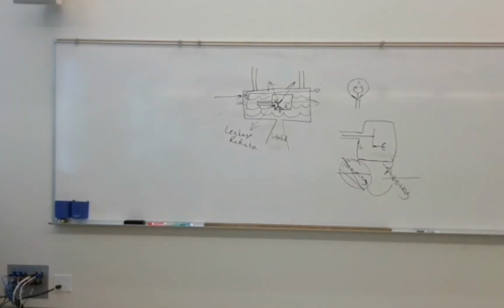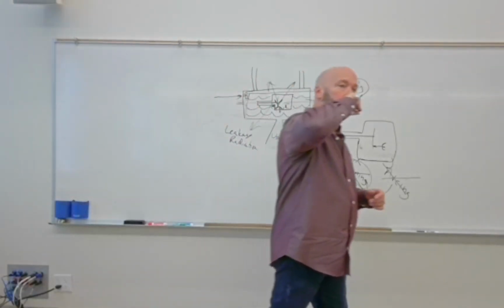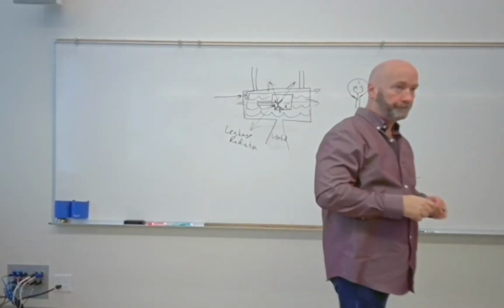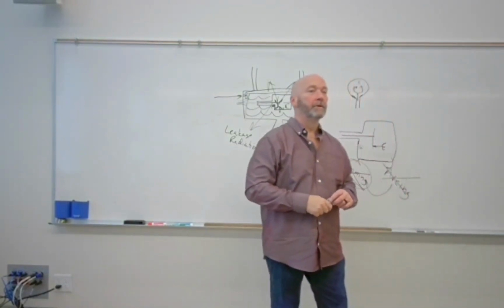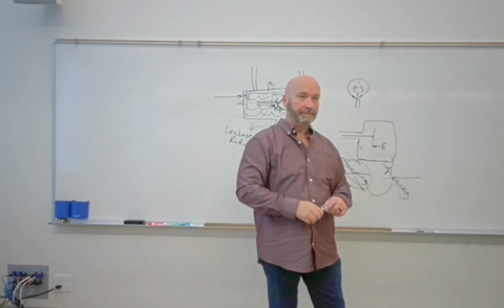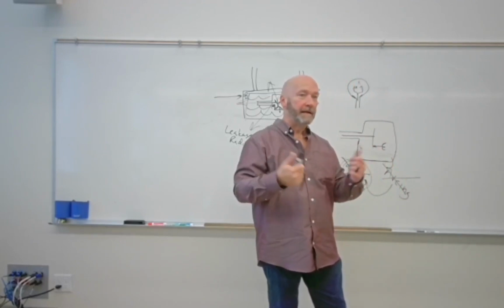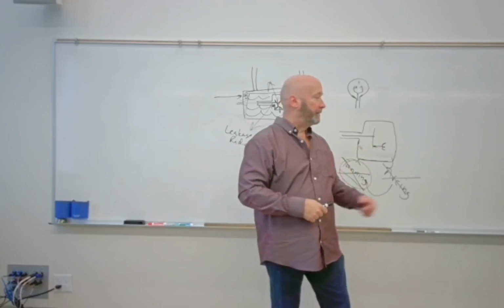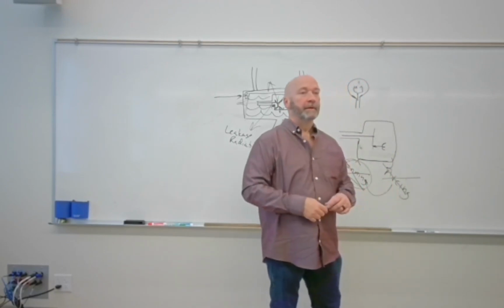So the internal components then become really what you got? So if they break a tube, is it really just replacing it? Any real repairing really? No, it's just replacing. Yeah. Because it's a vacuum. So if it loses vacuum, you get a gassy tube, it's a new tube. If you burn out the filament, it's a new tube. You got arcing, it's a new tube.